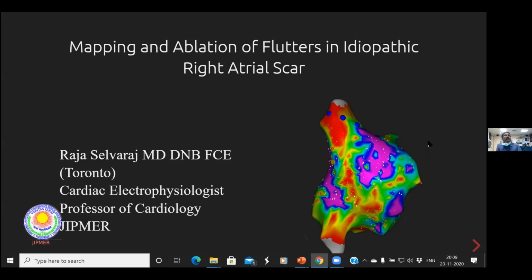Why should we be keeping it so deep inside? You can perforate the heart. We can map inside the LVOT and left under the valve on the LCC, the left coronary cusp. We'll start with the outflow tract. Great stuff. Thank you very, very much.